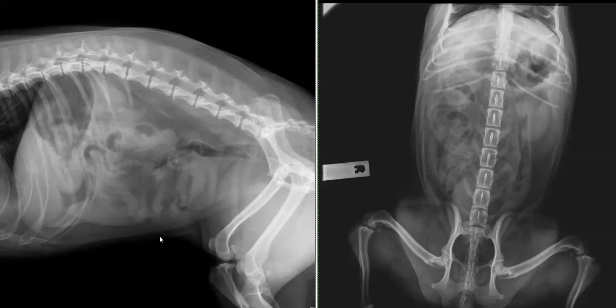So we've finished pretty much with the abdomen. Finally, because we've got all the information here, I run my eyes over the pelvic limbs, the pelvis — particularly important in cases of trauma — the spine on both projections, the ribs, and finally the edge of the thorax that we've got on the abdominal radiograph. Once I've looked at all of these structures in order on both projections, then I know that my interpretation is complete.